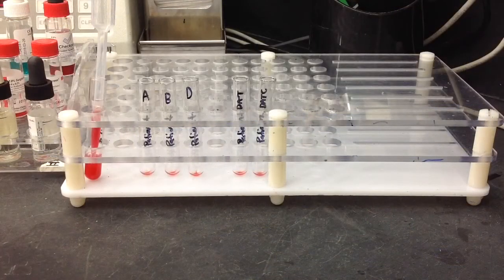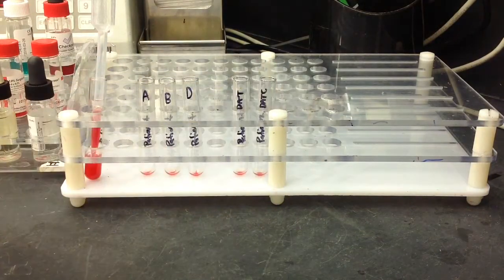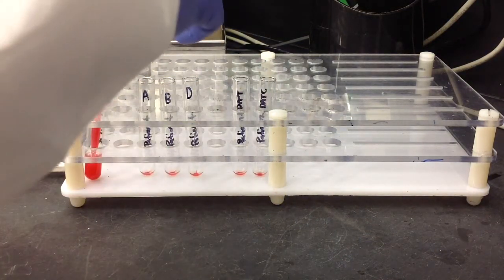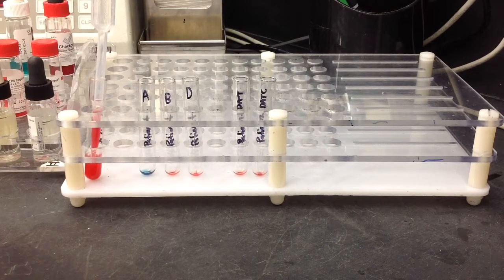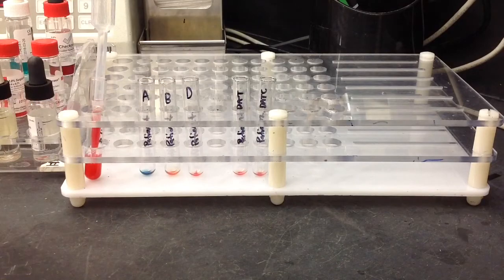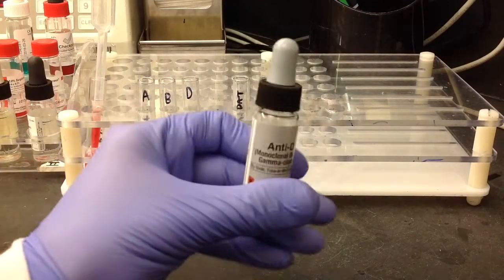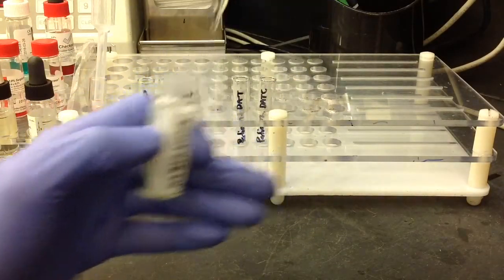After the washing is complete, I'm going to start with the ABORH portion. And I'm just going to add one drop of each of the antiseras into the corresponding tubes that I have labeled. So just one drop of the A, the B, and then finally, just one drop of the D antiserum.